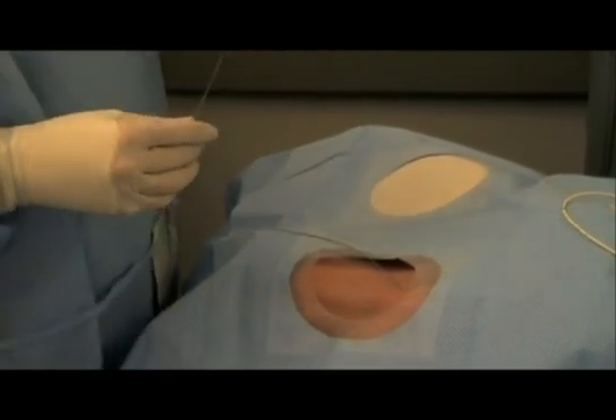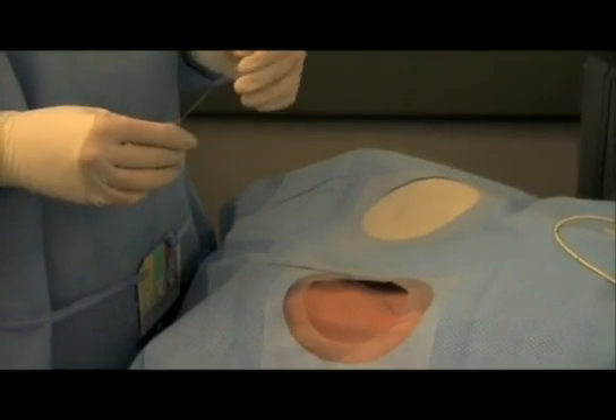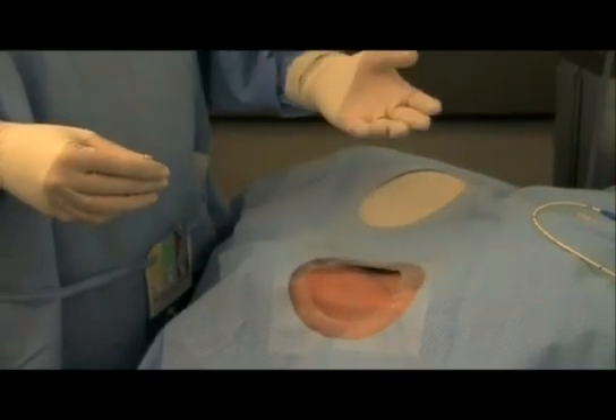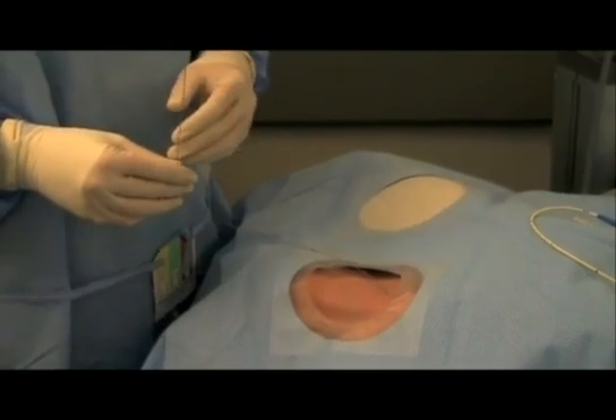If you just hit the artery with your 18-gauge and you haven't dilated it, chances are that vessel is going to be just fine. This will really depend on your individual institution as to what your departments want done in this situation, but having not dilated it, it's a much safer situation.